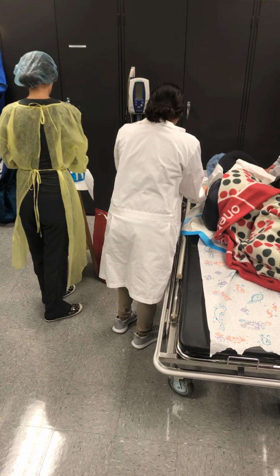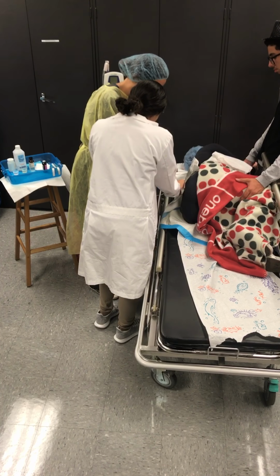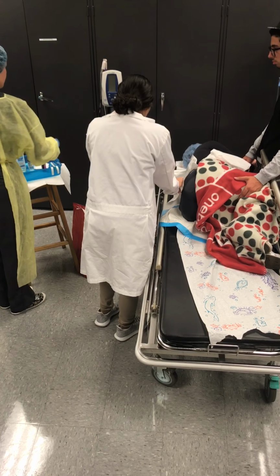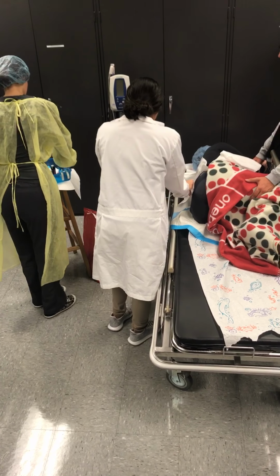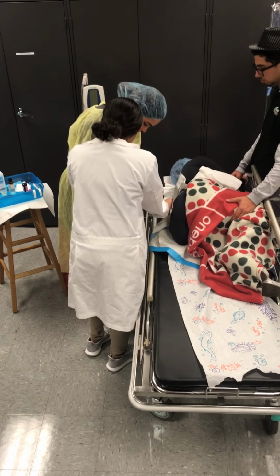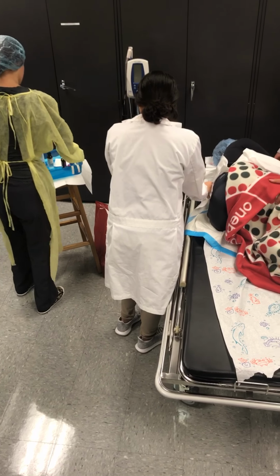Assists the patient to maintain the knee-chest position. If you could just help her maintain her knees as close to her chest as possible. Passes lavender tube. Helps provider with syringe. It's okay, sweetie, just breathe. Okay, good. Helps provider with swab.